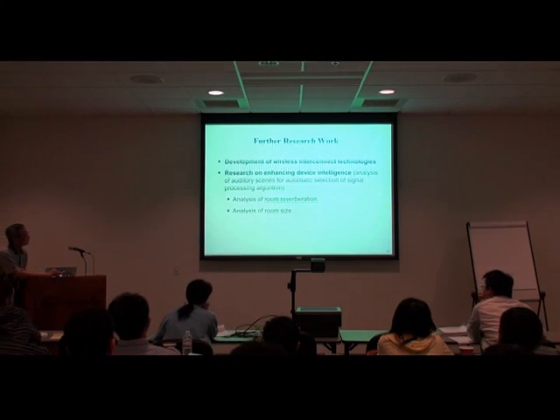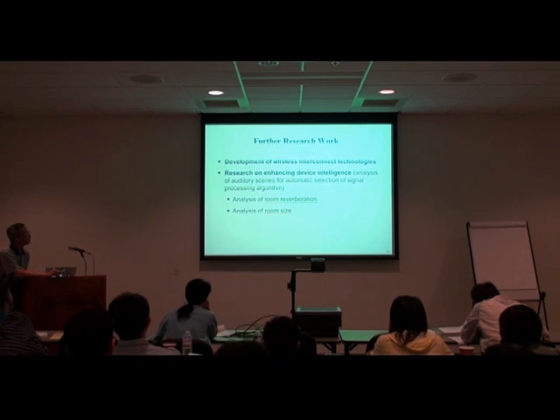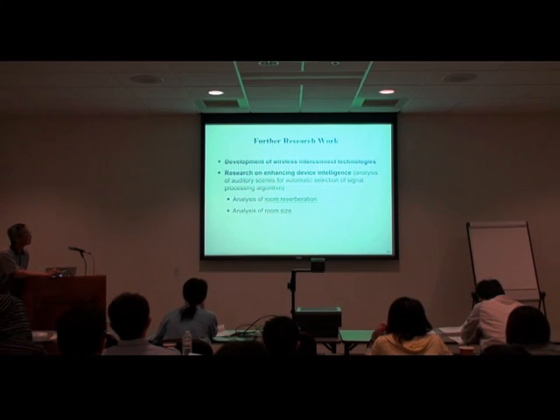And for the further research work, as I said, we have to combine the signals from two microphones. And clearly, the ideal way is to produce interconnect technology using the wireless. So we have to allocate a team of students and postdocs to develop this wireless interconnect technology. And we have developed that.